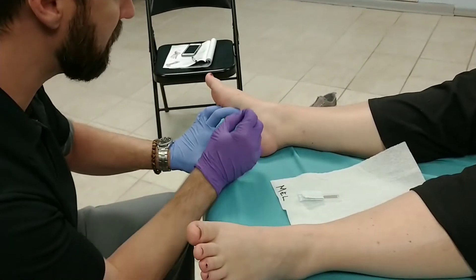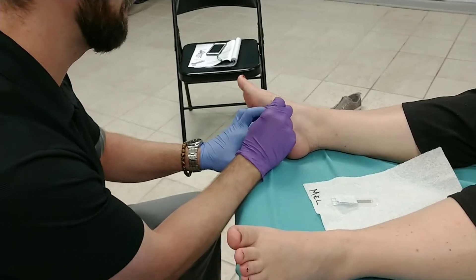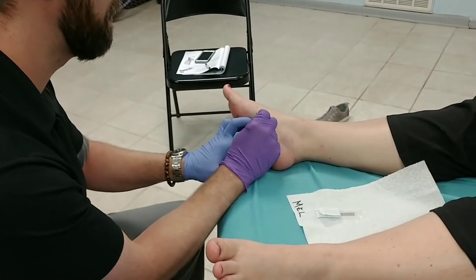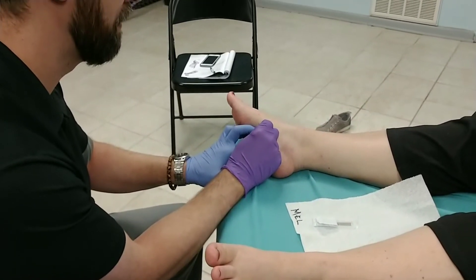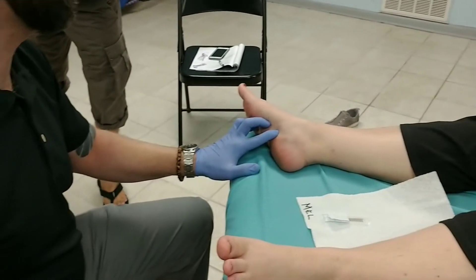For needling, I'm going to come in from this side angle. Nice deep breath for me. Kind of Kidney 2. Flexor digitorum brevis — that's not necessarily horrible.